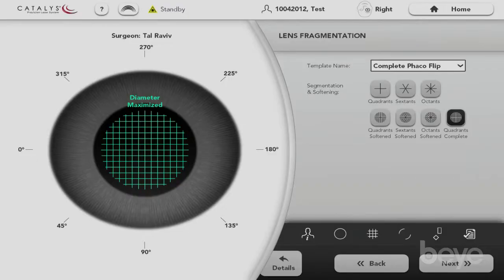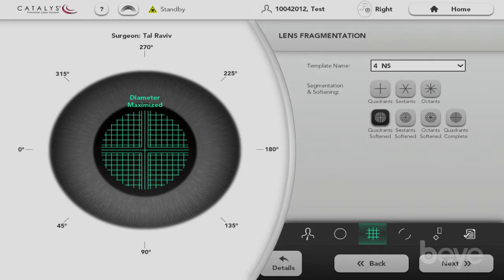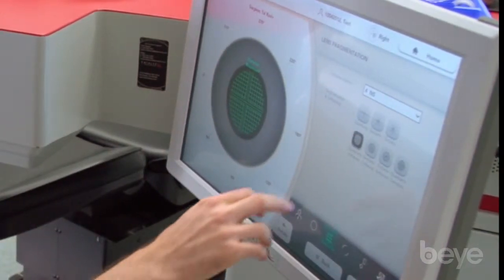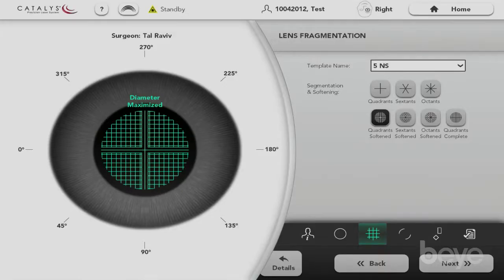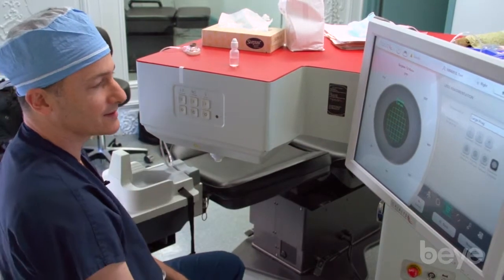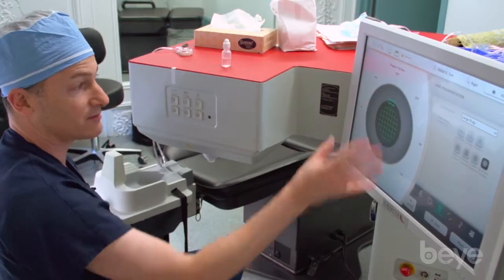Moving forward, the surgeon has a wide array of choices for how to fragment the lens. We can do segmentation as well as softening for dense lenses. I have a number of defaults — for example, my 'four plus' setting for an averagely dense lens does segmentation with a very narrow fragmentation pattern. For very advanced dense lenses I go even tighter, and then I have a 'large frag' setting for soft lenses that don't need to be broken into small pieces.